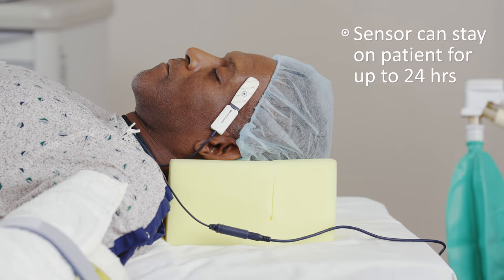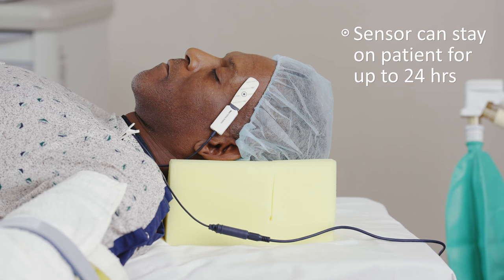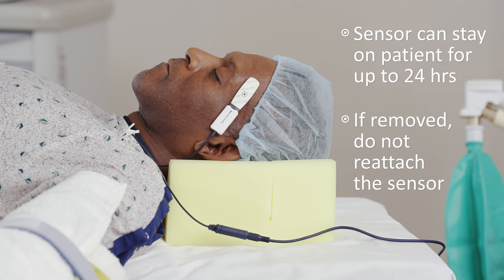The sensor can stay on the patient until it is no longer required to monitor core temperature, up to 24 hours. If monitoring time exceeds 24 hours, a new sensor can be applied. If removed from the patient, the Temple Touch Pro sensor should not be reattached, as it might weaken the adhesive, damage the sensor, or compromise system performance.